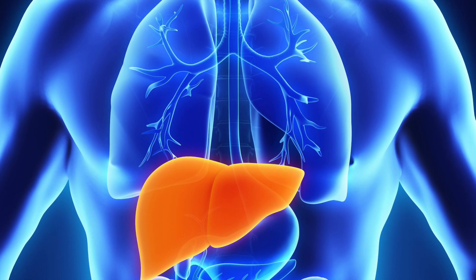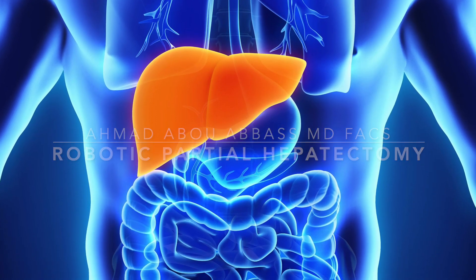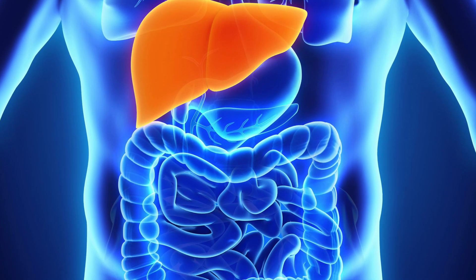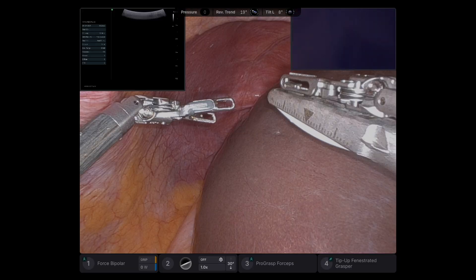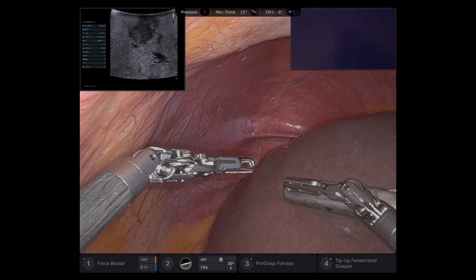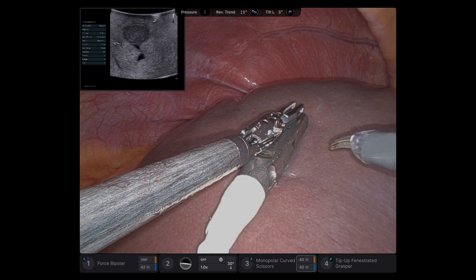This is a simple robotic wedge partial hepatectomy from segment 8. The patient has a bump under the right side, and had a neuroendocrine tumor metastasis. He also had another one in the left lateral segment.